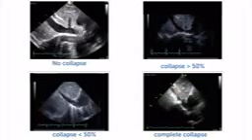Here are different variations. You can also use the M-mode to look at the motion or the collapse of the IVC. However, that is sometimes very difficult because, remember, when you let the patients inhale, the IVC and the diaphragm move. And so you will sometimes have to kind of follow the IVC while the patient breathes. So that can be a little bit of a problem.